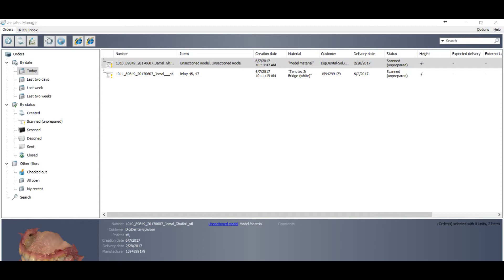Welcome to Digital Dental Technology. This video is the second part of the series on how you can convert DCM files into STL files without any extra software, without CAD points, or without model builder.